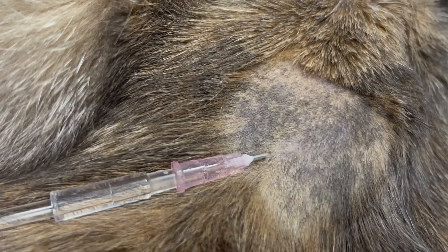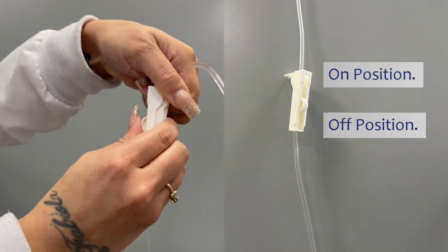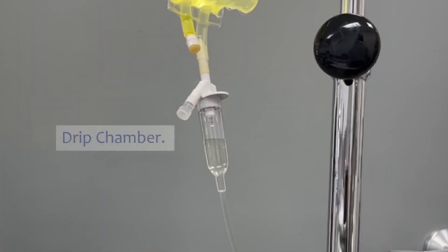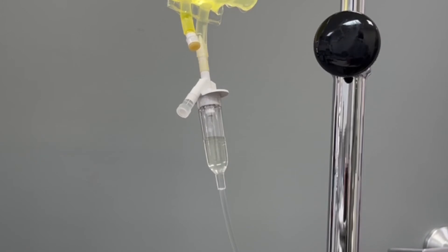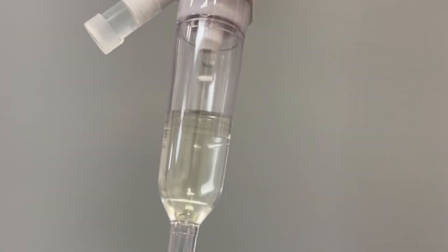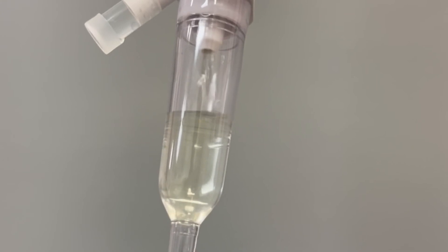With the clamps on the line, the one that has the roller on it — if you roll that up the fluid should start flowing. To see whether or not the fluids are flowing and if they're going fast enough, you want to look up at the drip chamber; it should be a nice steady stream. If it's not moving at all or it's just dripping slowly, make sure you don't have the line clamped off somewhere else, or see if you need to move the bag further up so that it's going at a nice steady pace.